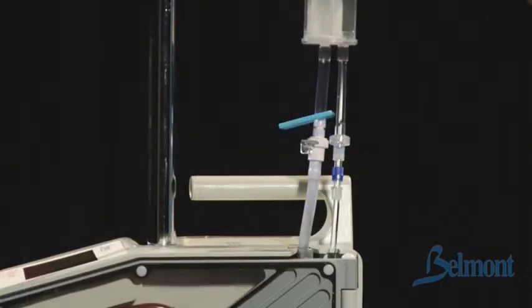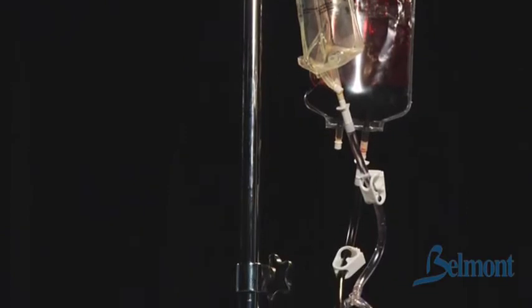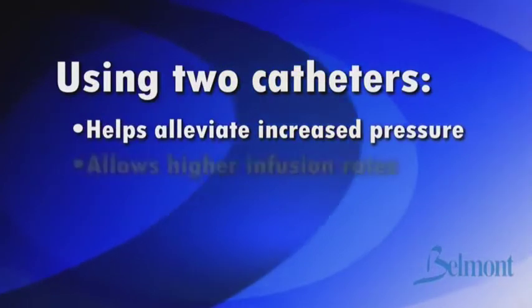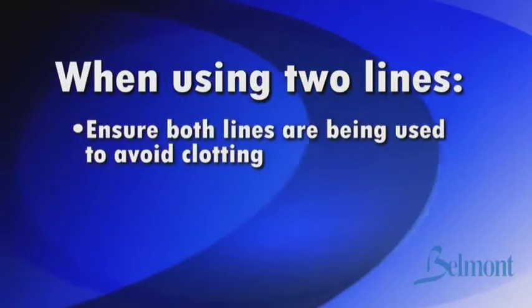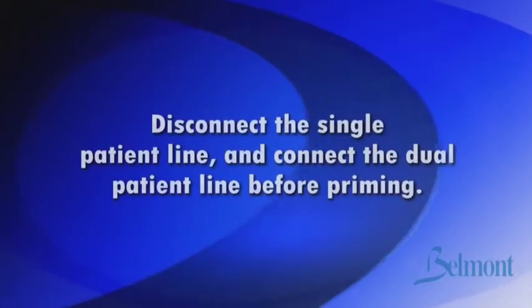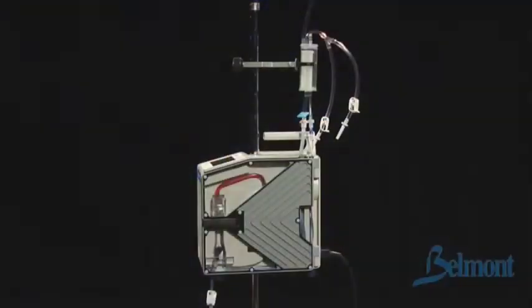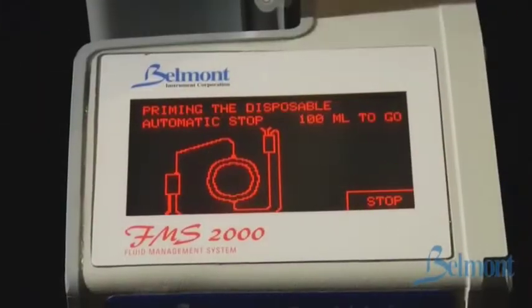An optional dual patient line is also available. It is useful when infusion rate is limited by high system pressure due to less than optimal catheter availability. Using two catheters instead of one can help alleviate the increased pressure and allow higher infusion rates to be used. When using two lines, be careful to ensure both lines are being used to avoid clotting within either catheter. To use, simply disconnect the single patient line and connect the dual patient line before priming. The disposable is now installed and the system is ready to go. After the first few times, you'll be able to get this system up and running in less than one minute.